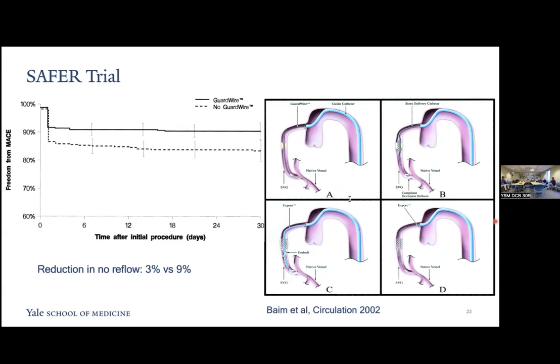The problem was aspirating everything, and something gets caught between the balloons, so you can't retrieve all the debris that embolizes. Plus, we couldn't inject contrast when you were putting the stent in, so sometimes you hit it, sometimes you didn't. Yeah, as Satara likes to say, the dark days of angioplasty.